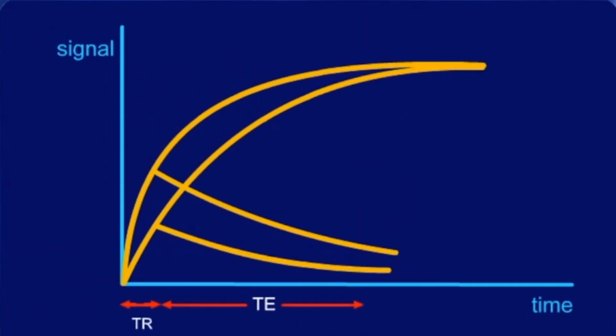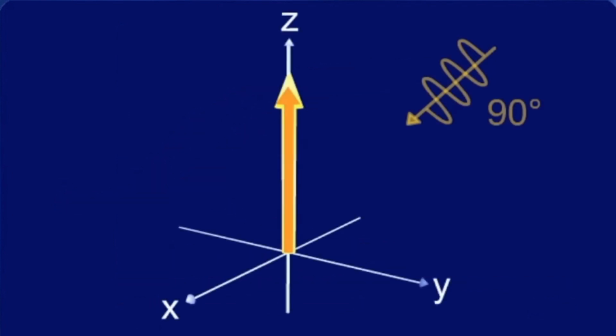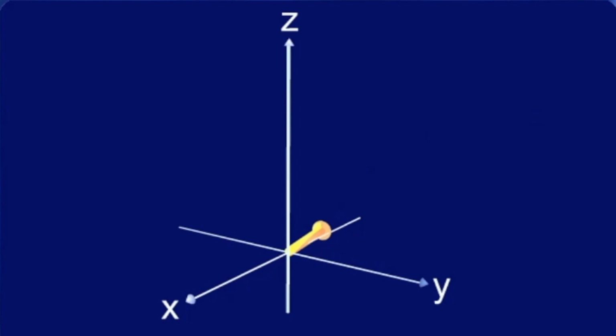What to do about the second problem? The small amount of longitudinal magnetization with a short TR. The 90-degree pulse, for example in a spin echo sequence, abolishes longitudinal magnetization. Longitudinal magnetization, however, starts to recover immediately after the 90-degree pulse, depending on the T1 of the tissue examined.